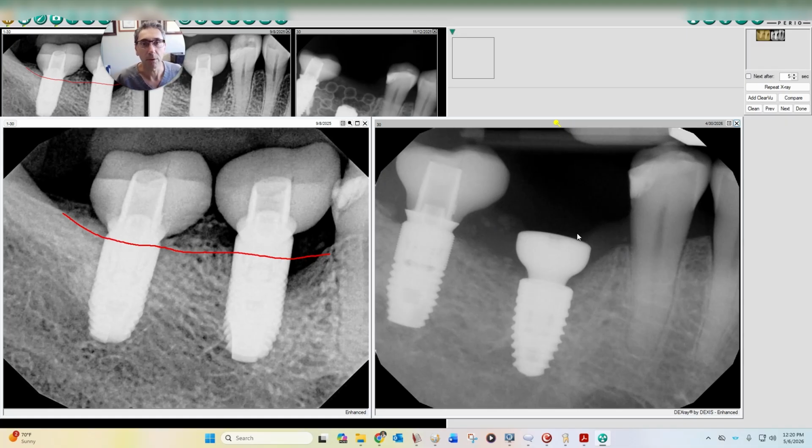And the most important part is the mucosal seal. We have a very good connective tissue and mucosal seal for that new restoration that will protect the implant from future bone loss, compared to the old one, where you can see there was a shallow placement and no seal around it, and that's why it went through that vertical bone loss, peri-implantitis, and implant infection.